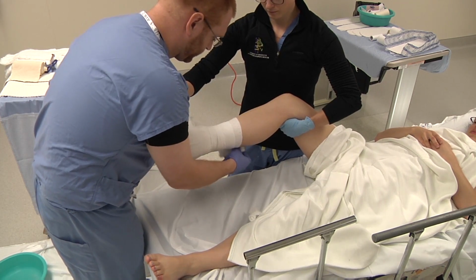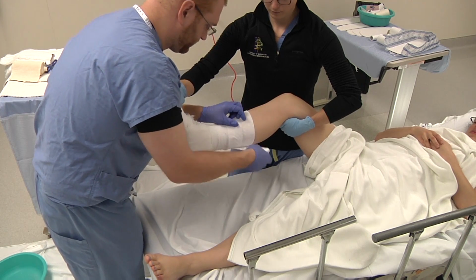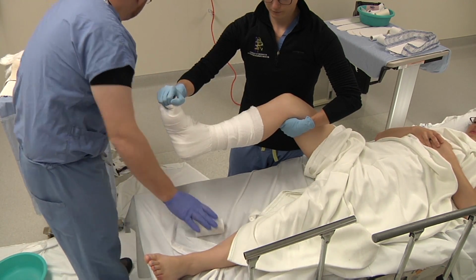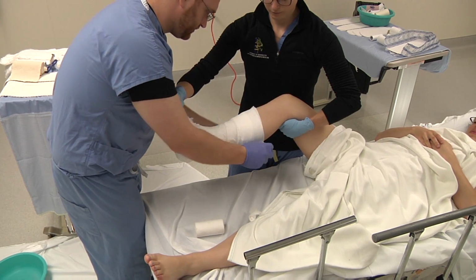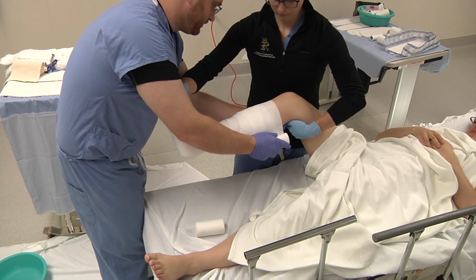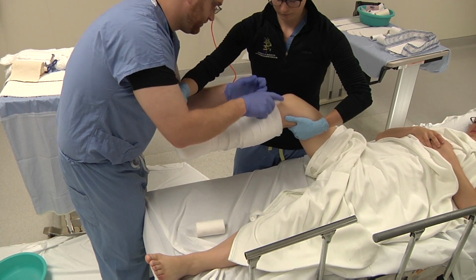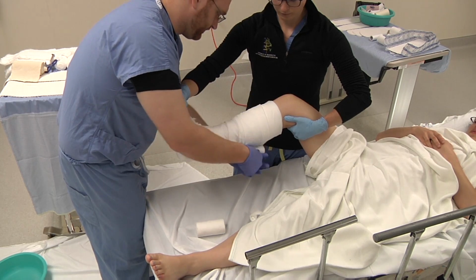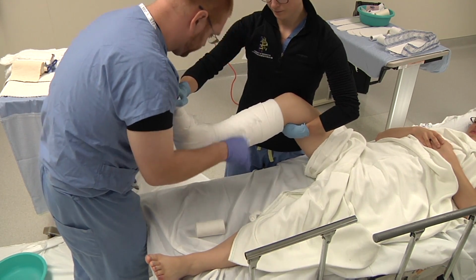From there, we work up the leg with a minimum of 2 layers. Having adequate supplies is very important. Know where your popliteal crease is at the top. Minimum of 4. Go back over any areas where you think there's insufficient padding.